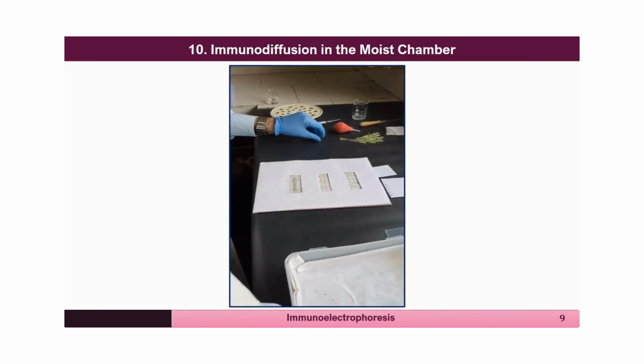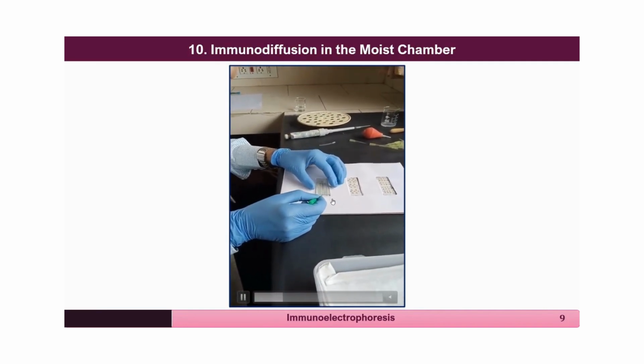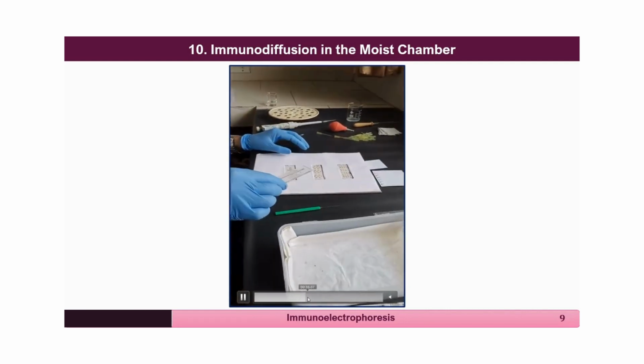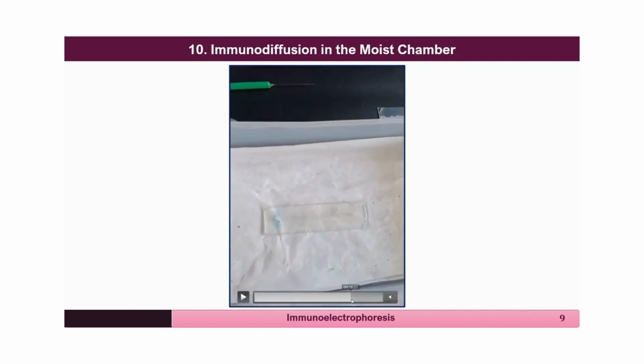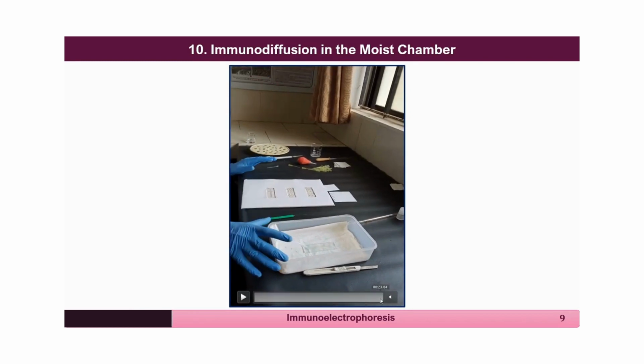The slide, once the antibody is loaded in the trough in the middle, is supposed to be kept in the moist chamber, and the result will be visible the next day, that is 24 hours after the immunodiffusion takes place.